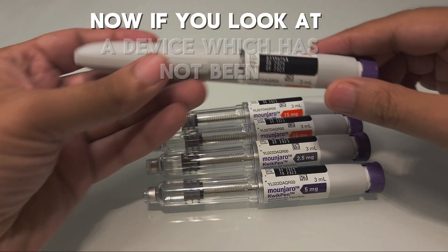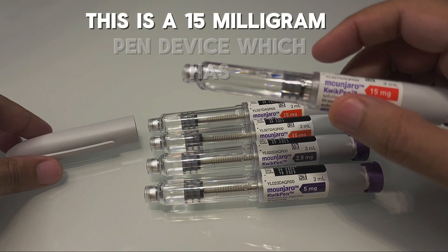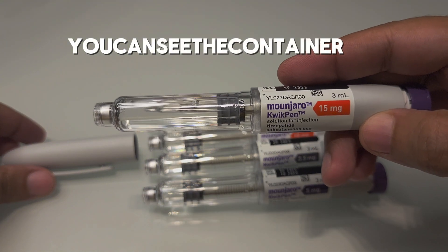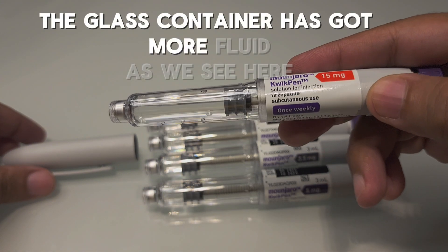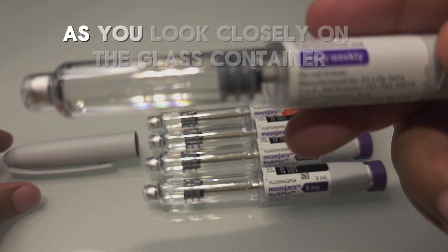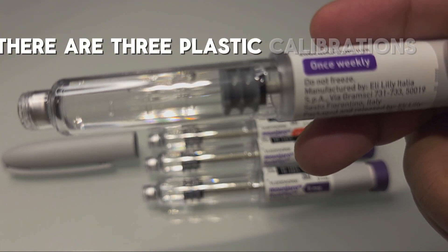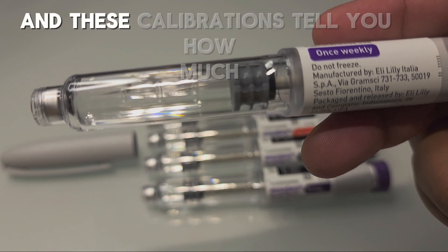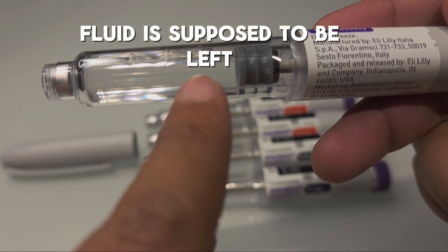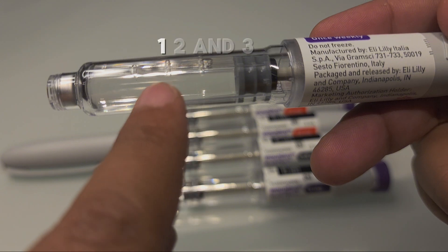If you look at a device which has not been fully consumed — for example, this is a 15 milligram pen device — you can see the glass container has more fluid. Looking closely at the glass container, there are three plastic calibrations, and these calibrations tell you how much fluid is supposed to be left after each dosage. There are three marks: one, two, and three.